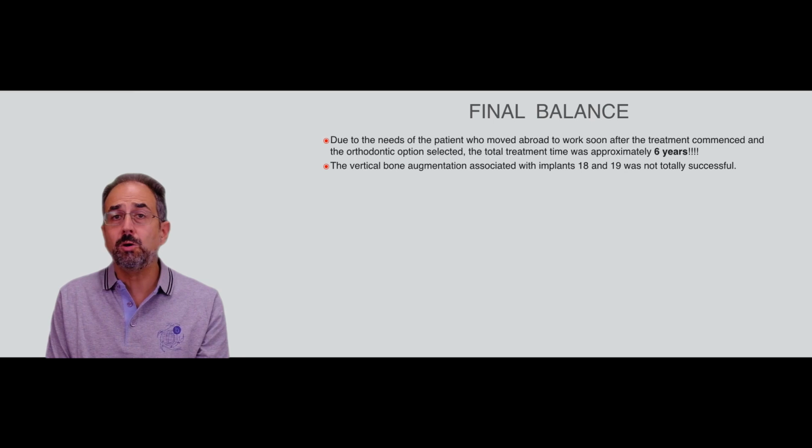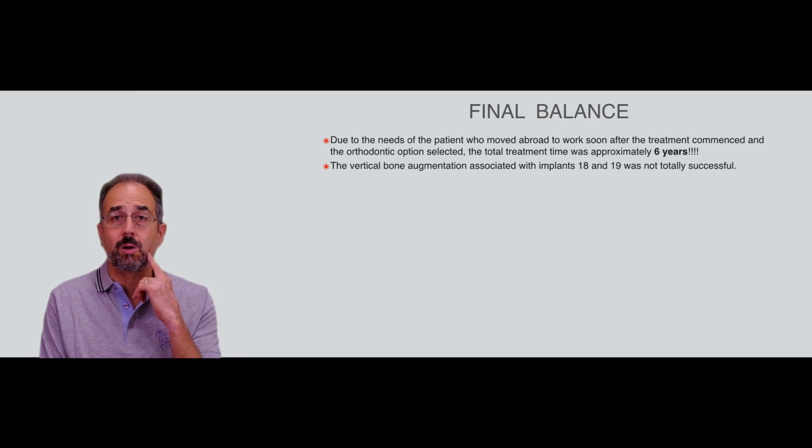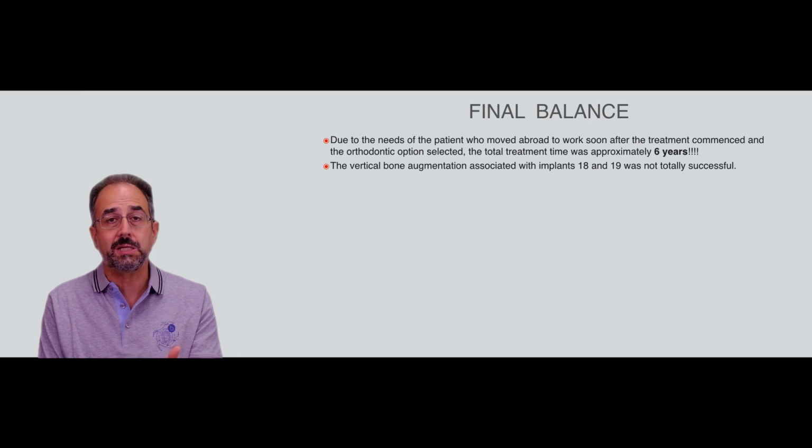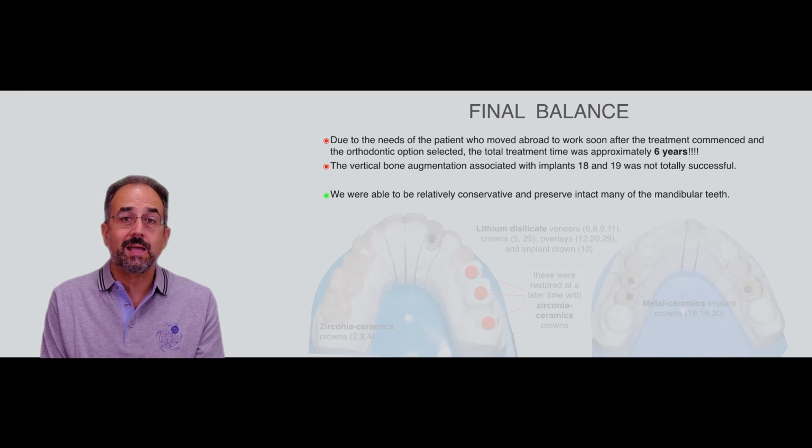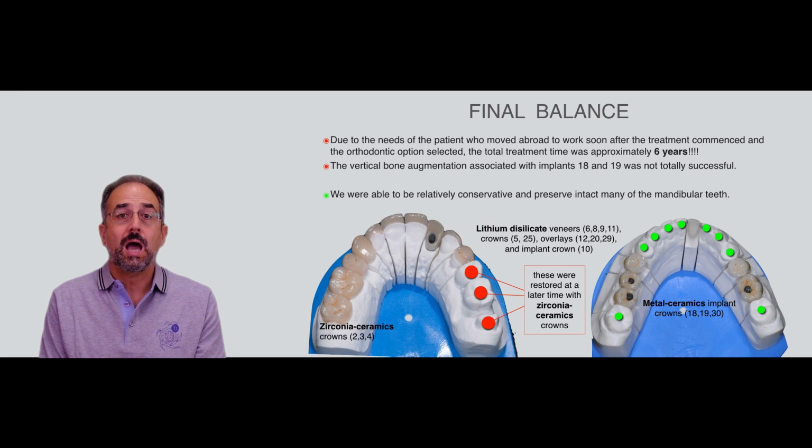Also, the vertical bone augmentation that we attempted, especially in the lower left, did not succeed 100%. And I'm not too happy about that either, but this is part of the game when you do this type of surgical treatment. The good thing is that thanks to the orthodontic therapy, I was able to be fairly non-invasive. On a number of teeth, I did only veneers or partial restorations, and in the lower arch especially, many teeth were not restored almost at all. So this was definitely good and positive.